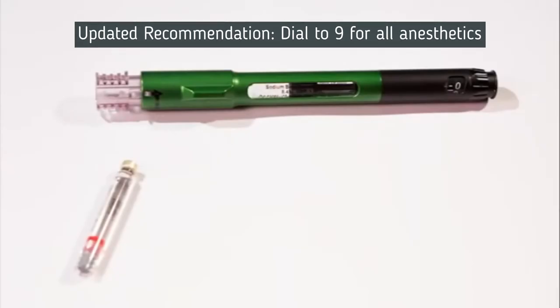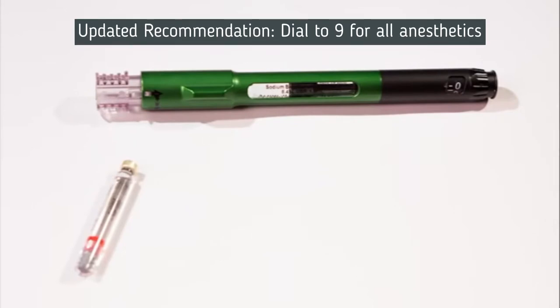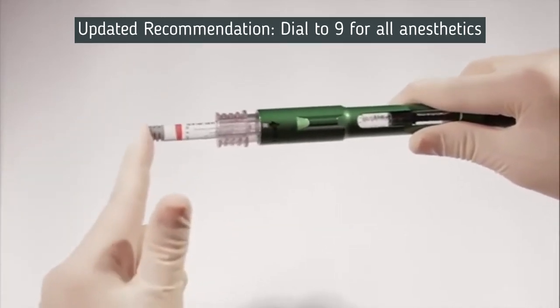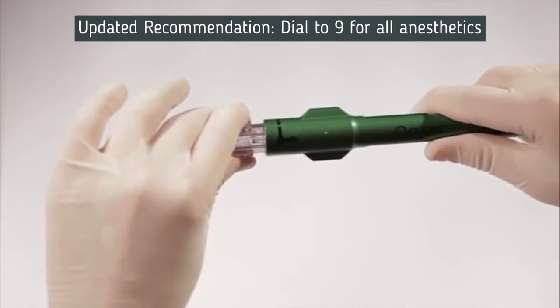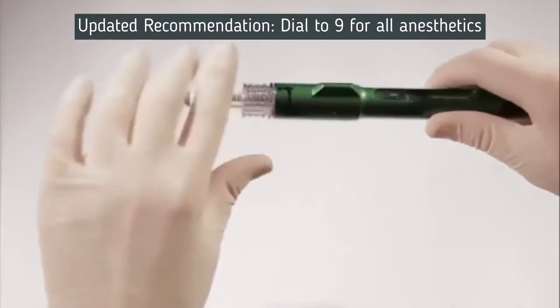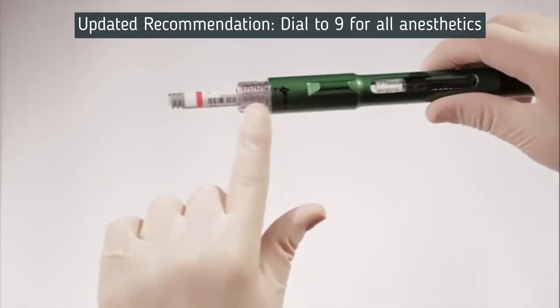Compounding solutions using the mixing pen is a single operator process that is easy to do. Once the pen is assembled, 1.8-milliliter cartridges can be mixed one at a time by following these 3 easy steps. Step 1: Load a 1.8-milliliter cartridge into the cartridge connector, making sure it's fully seated at position number 1. Then turn the connector clockwise one quarter turn to lock the cartridge at position number 2. Then push in the cartridge connector to position number 3. The path going from positions 1, 2, and 3 and then back is shown on the pen.